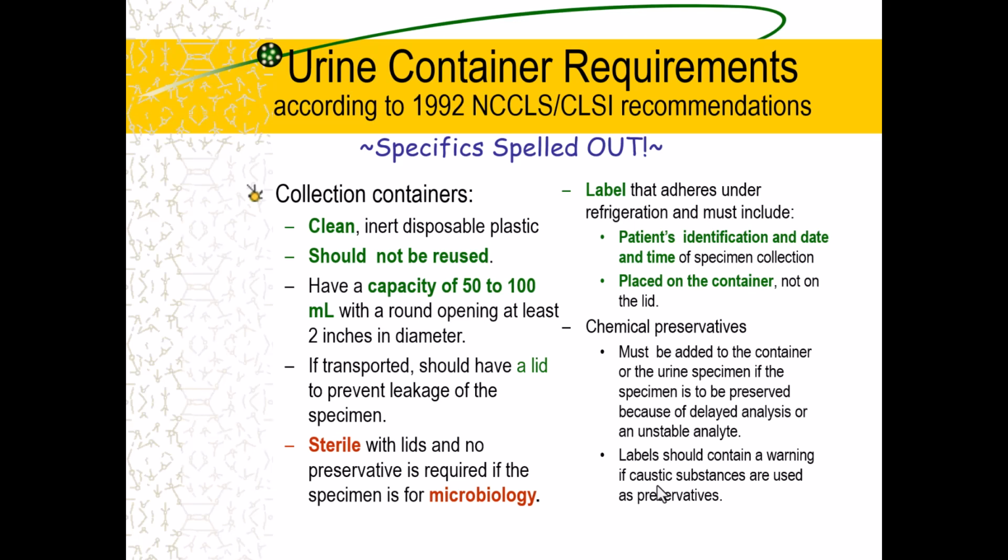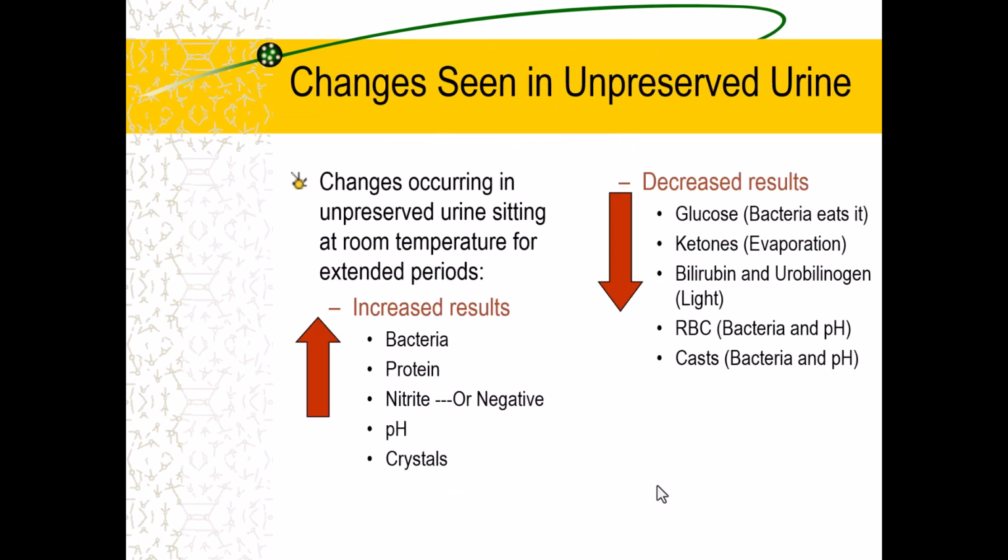So remember we talked about bleach earlier? We're going to talk about bleach on a lot of these strips because bleach affects results. If they don't understand that bleach affects results, which they did not until I talked to them, and then they started rinsing better. They used to just do a quick rinse and then let it dry, thinking, oh, the bleach is okay to still be on there. It affects the results. So different countries, different policies. This is a US policy.